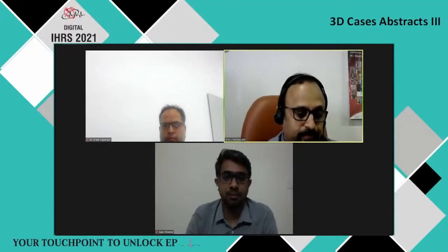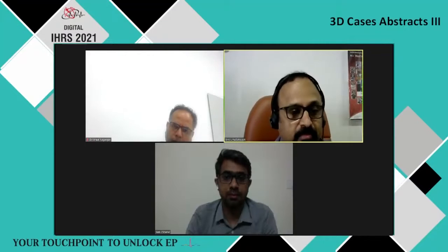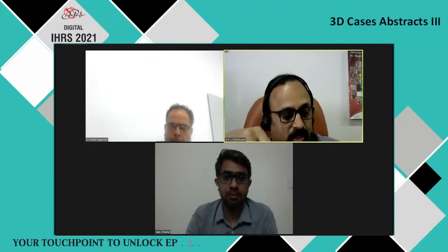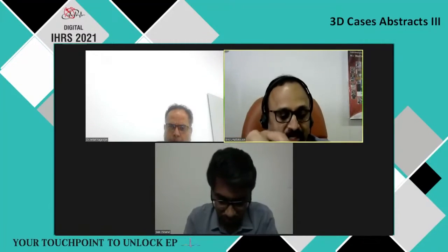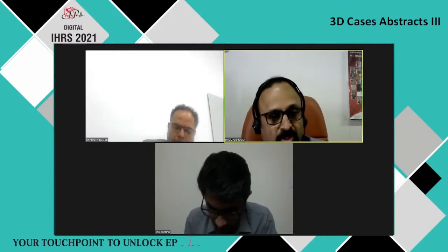Thank you, Arun. So the first case was by Dr. Sam. Is Dr. Sam there? Can you unmute yourself? So you presented a case of RA flutter and LA flutter, right? You said during the ablation, the flutter pattern of atrial activation as well as the cycle length changed. So the shorter cycle length RA flutter, in your opinion, was suppressing the LA flutter, which became obvious when the RA flutter got terminated. Is that what you propose?